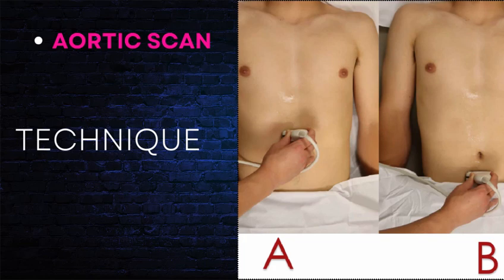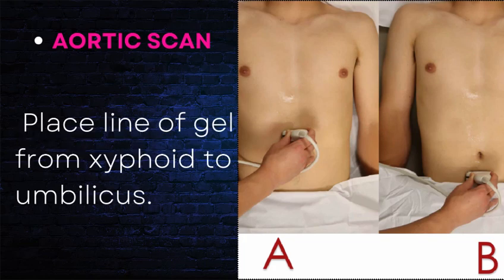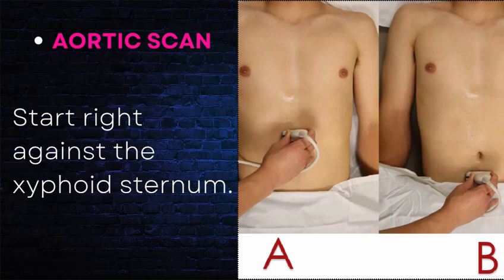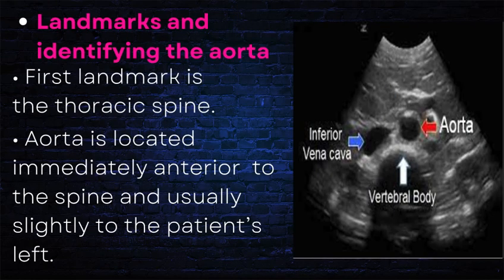Aortic scan. Technique: place a line of gel from xiphoid to umbilicus. Using a curved array probe, place it with indicator to patient's right, transversely and perpendicular to the abdomen. Start right against the xiphoid sternum. Landmarks and identifying the aorta. First landmark is the thoracic spine. Aorta is located immediately anterior to the spine and usually slightly to the patient's left.